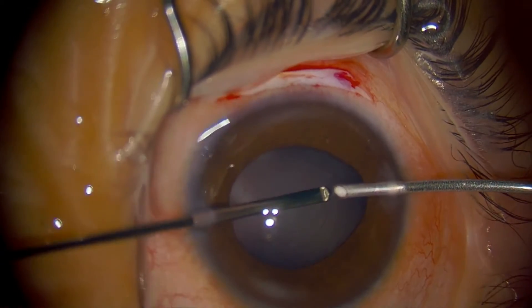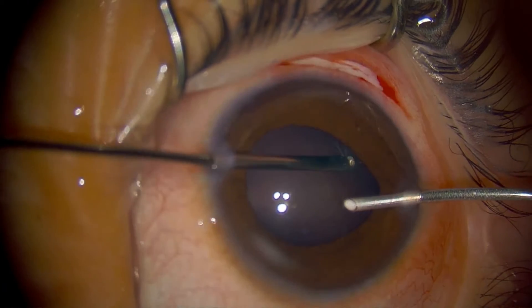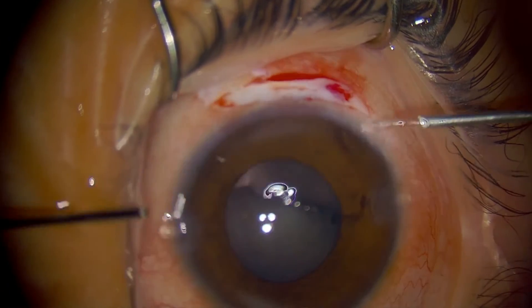As we mentioned, in cataracts we like to remove all cortical material — that way you can cause less inflammation. That looks pretty good; there's some cortex here. That's pretty much done — the lens is out.